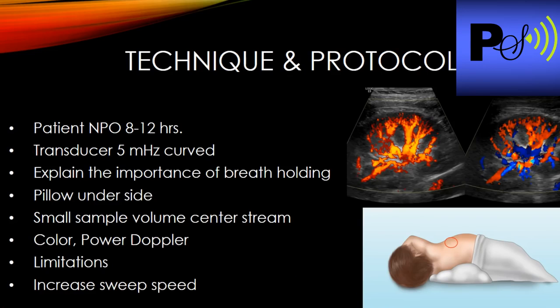When you're Dopplering the vessels, you want to use a small sample volume, so 3 millimeters, 2 millimeters. You want to be able to use color Doppler in difficult patients, or even in non-difficult patients. You could also use power Doppler. You get really nice images.